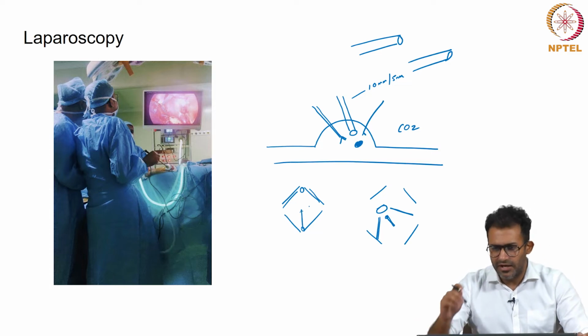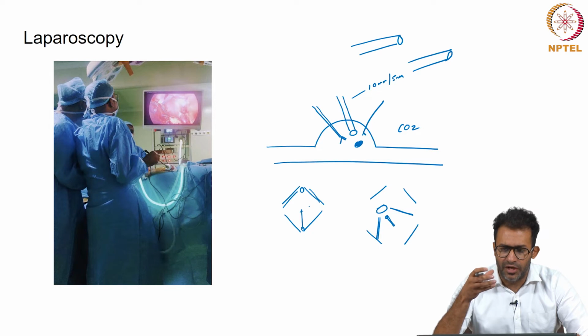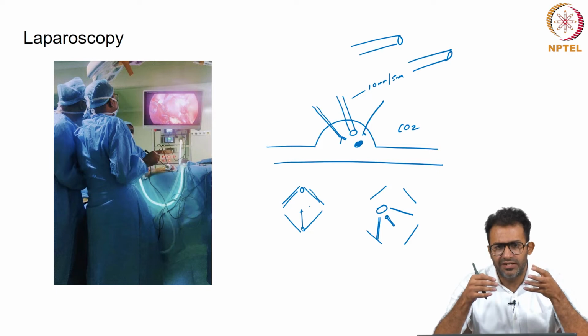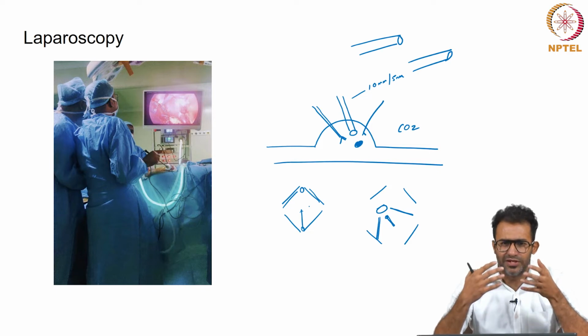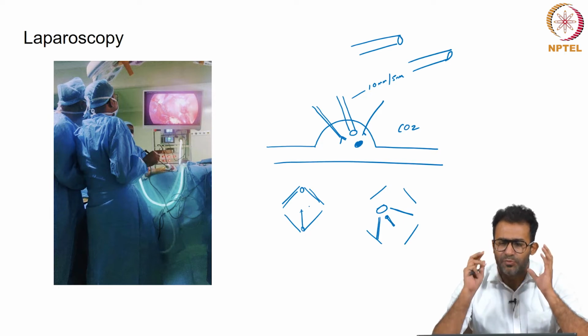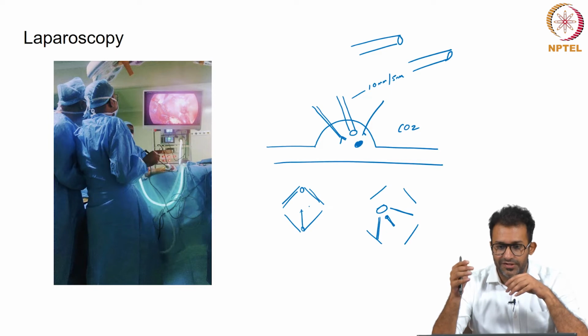I'm not going to delve too much into the principles of laparoscopy, but the major challenge in laparoscopy is that you're not touching the organ with your hands. So you lose that tactile sensation, and for 200, 300 years, we have been taught that surgery is a very tactile art. You feel the organ, you touch the organ, and that is something we lose with laparoscopy. But the advantage is that it provides a degree of magnification which is not possible with conventional open surgery. So there are certain advantages, there are certain disadvantages, and robotic surgery is a type of laparoscopy.